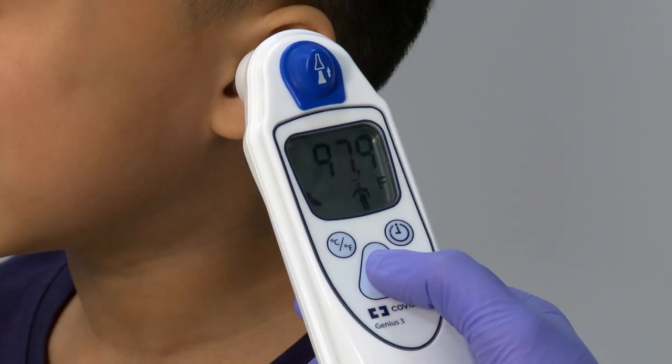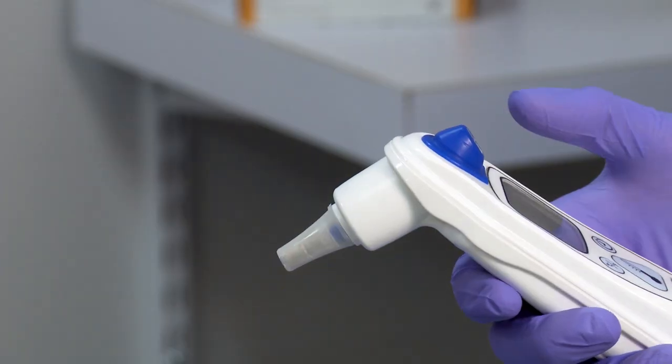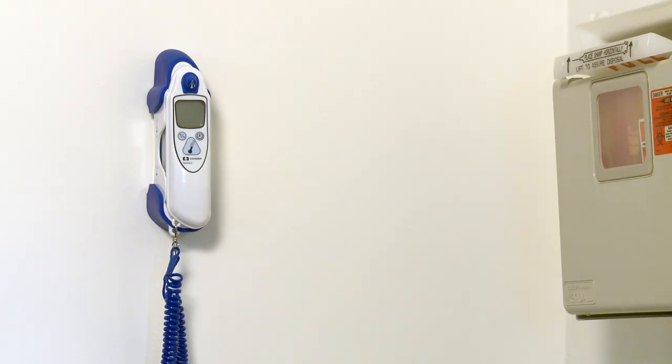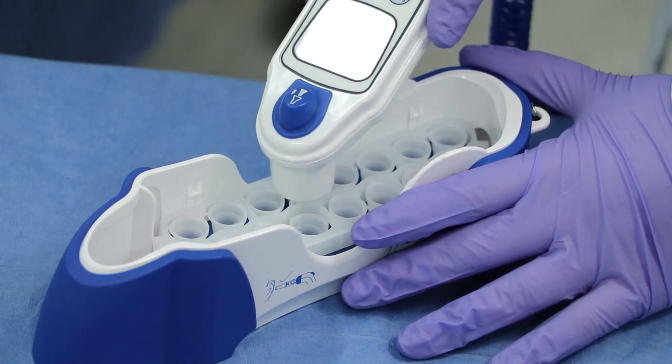Wait for a triple beep before removing the thermometer. The patient temperature will be displayed. Press the eject button to eject the probe cover into a suitable waste receptacle. Always return the thermometer to the base for storage and never reuse a probe cover.